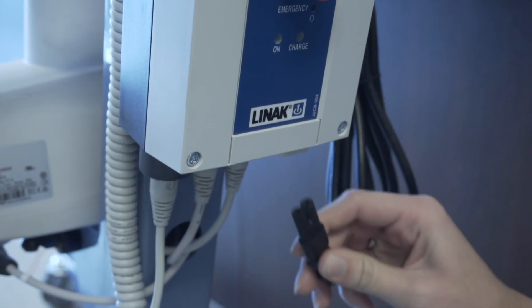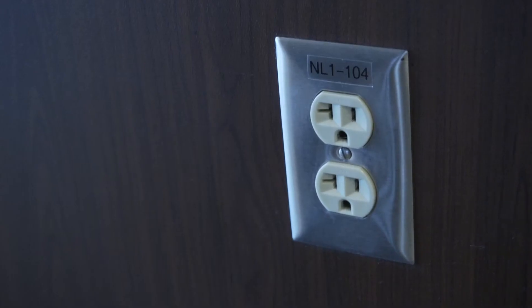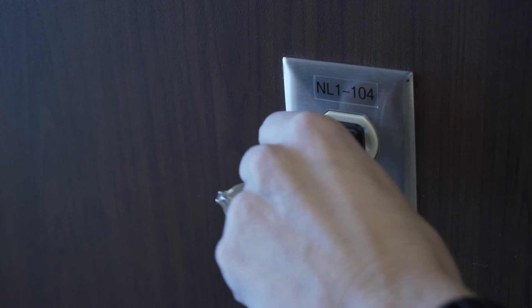To charge the battery, plug the AC power cord into the bottom of the control box and plug the other end into a wall outlet.